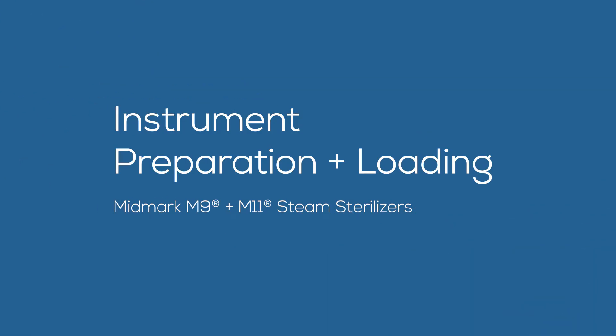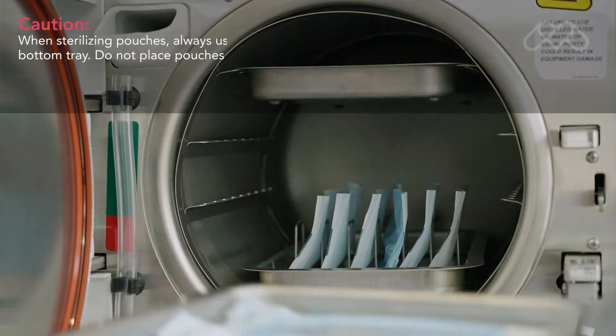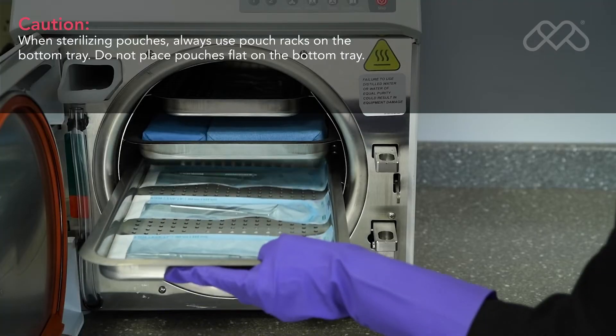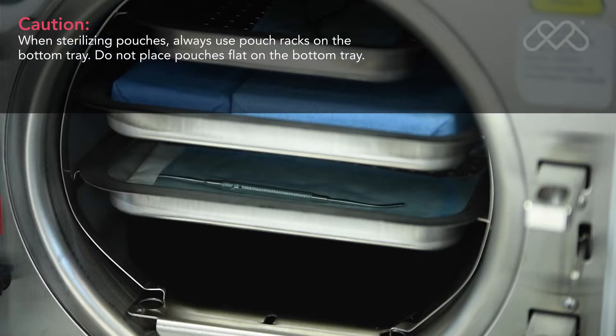This video provides an overview of the preparation of instruments for sterilization and loading of the Midmark M9 and M11 steam sterilizers. Always refer to the appropriate technical documentation for the complete list of instructions, safety alerts, and sequence of procedures before conducting any service or maintenance operations.